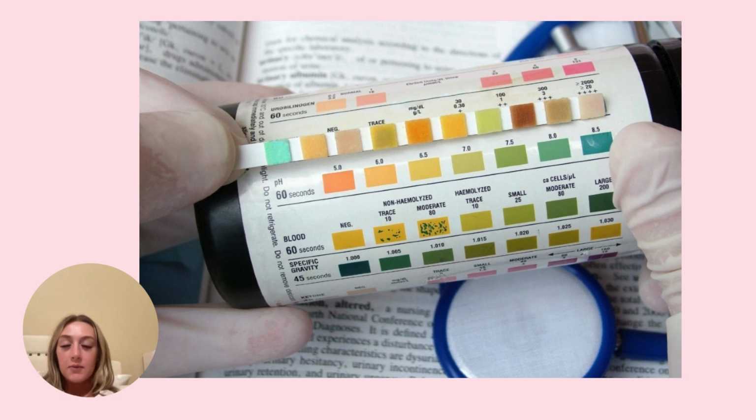Okay, next, this is something you'll also see in urinalysis, pretty common. This is a pH indicator. As you can see, she has a little test strip. This gets stuck into the urine sample and then taken out, and then they put it on the chart to compare and see where the pH is at. They usually do this after 60 seconds. They can also do this with blood in urine, but this example that I put up here is a pH one. So you can see it on the scale right there.